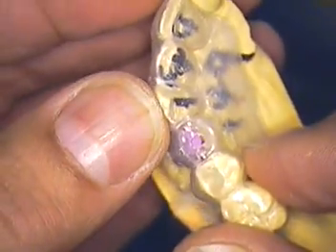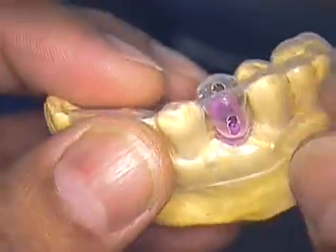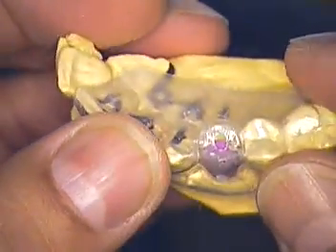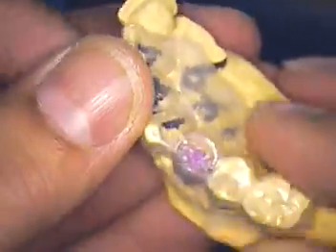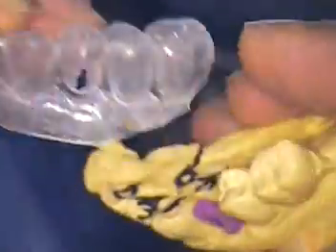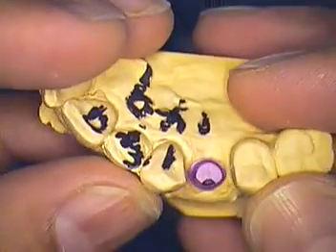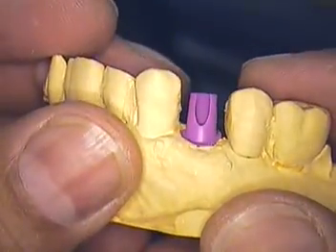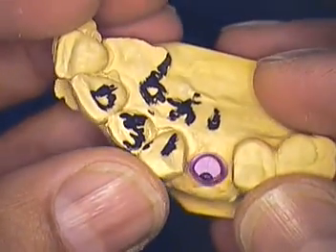I did measure it: we're about three millimeters from the lingual, about two and a half millimeters from the facial, and we need to do some occlusal reduction, take care of the margins, et cetera. So that's how we approach it. Every case like that, we just don't arbitrarily pick items and use them — there is a science to this, and it's been working for many, many years.